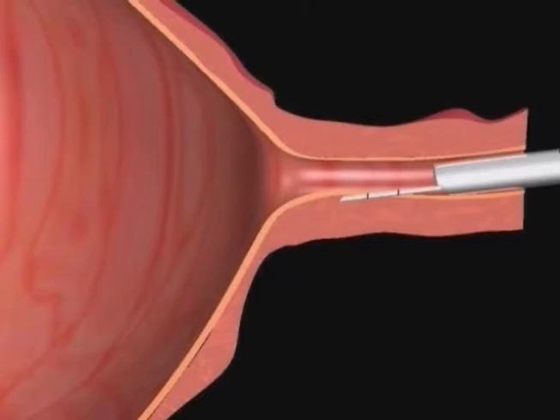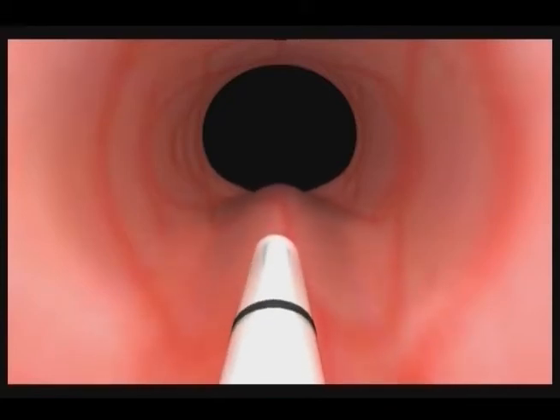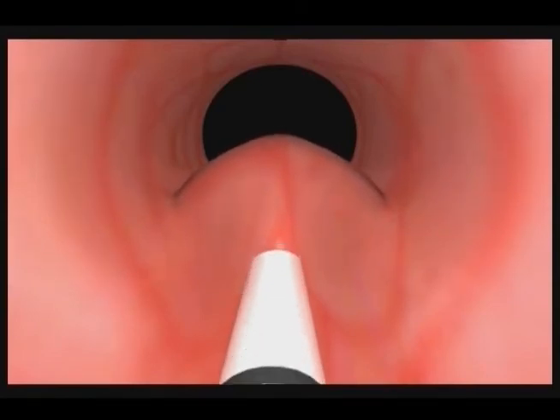It is important to use this tunneling technique to prevent an injection that is too superficial or one that is too deep. The bolus created at the 6 o'clock position is the largest; you will inject one entire 2.5 milliliter syringe of Macroplastique in this position.